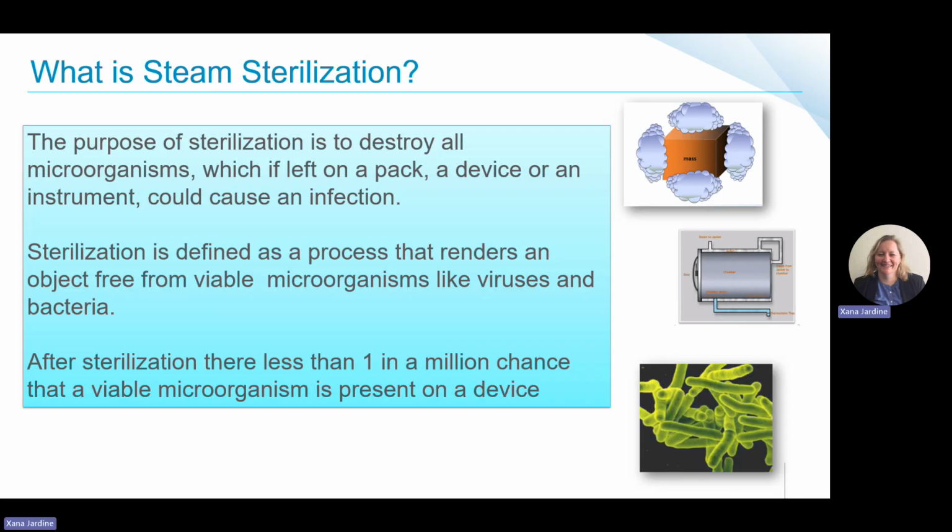So I'm sure you remember that the purpose of sterilization is to destroy all microorganisms, because of course, if left on a pack or a device or an instrument, a microorganism can cause an infection. Sterilization is defined as a process that renders an object free from viable microorganisms like viruses and bacteria.